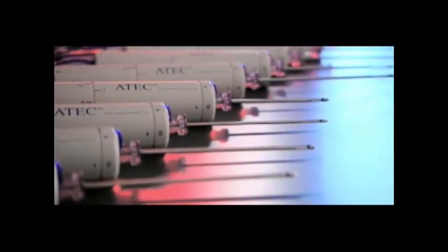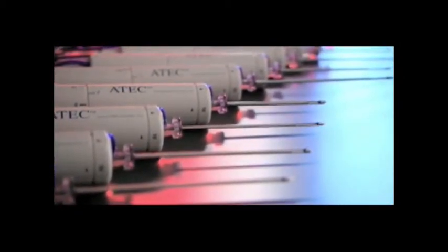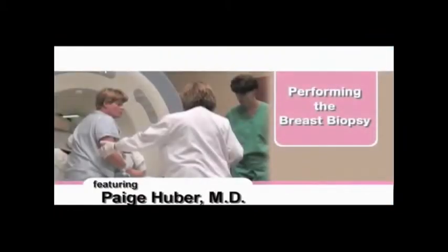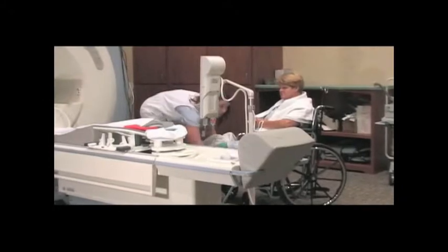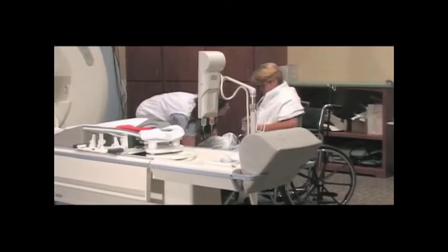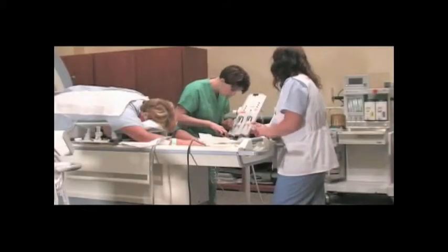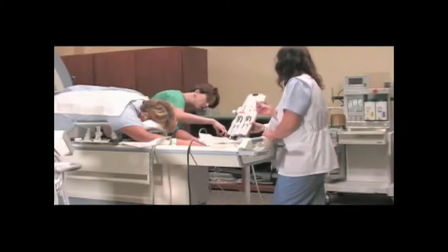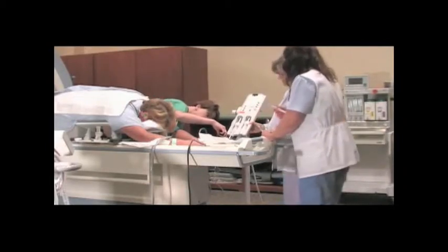The standard ATEC MRI handpiece is used during the procedure. Once the patient arrives in the MRI suite, an IV is started to facilitate the injection of the contrast agent to aid in visualization of suspect tissue.